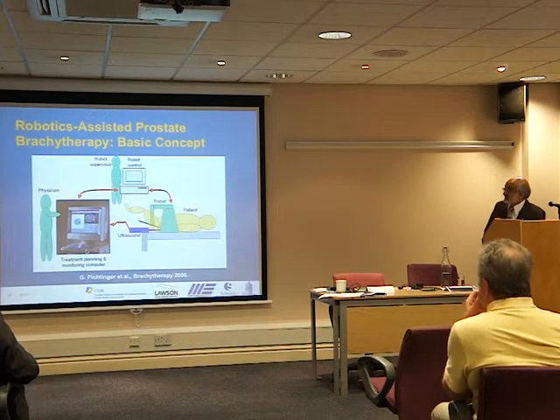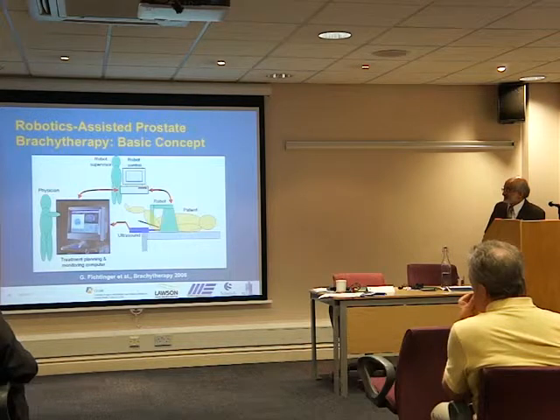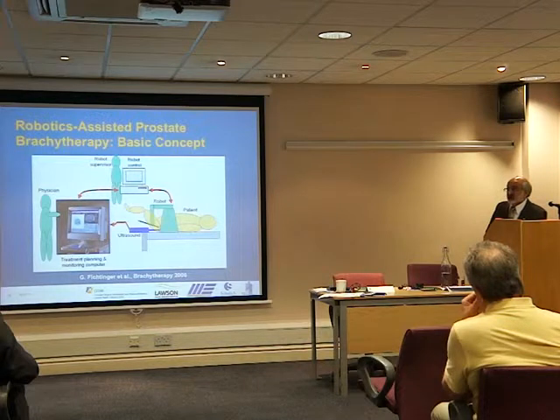So this is the general layout of a robotic-assisted approach to prostate brachytherapy. You can see that both the robot and the clinician are in the loop. And this is the way that it should be. So the robot is really an assistant to the clinician. It does not replace the clinician.